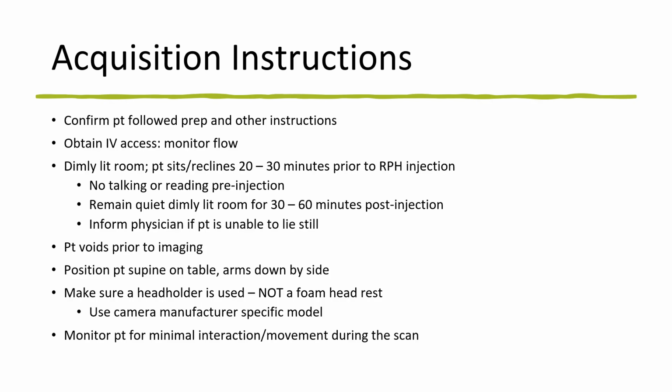And then you want to explain the test really well to them before you put them in that room and let them have that resting time because when you come back to inject them, you don't really want to talk to them. They're not allowed to really talk that much or read because that can affect the areas of the brain that get glucose.